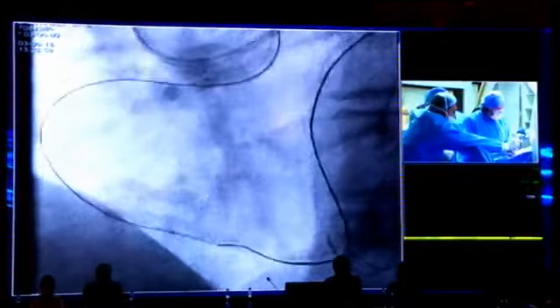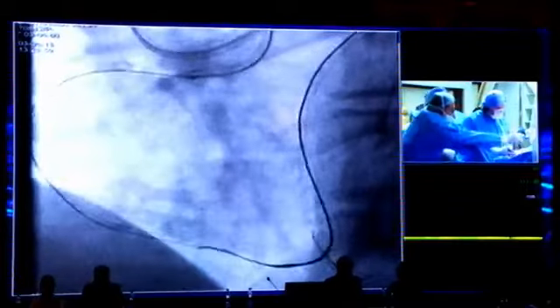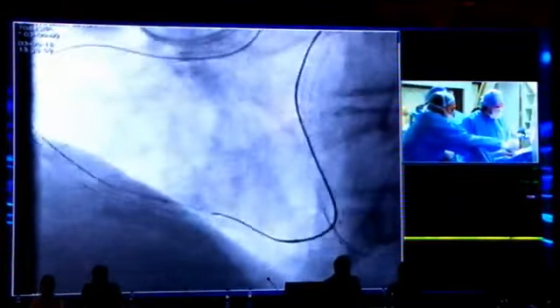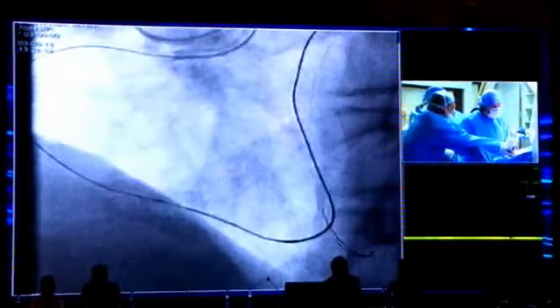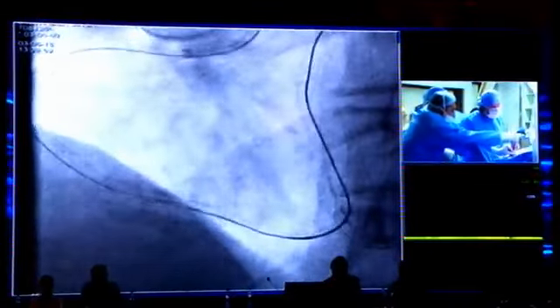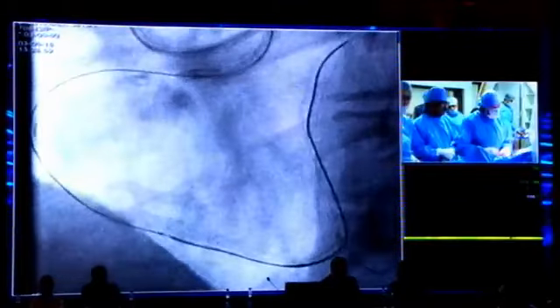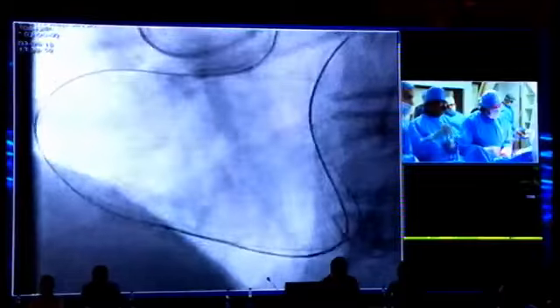But I think maybe the next option will be to bring a balloon antegrade where the wire is. But it has also grabbed the tissue already. Yes, it grabs the tissue. You feel it. Yeah, that buckling actually is not a good sign. Buckling tells you that the wire is going in the wrong direction.